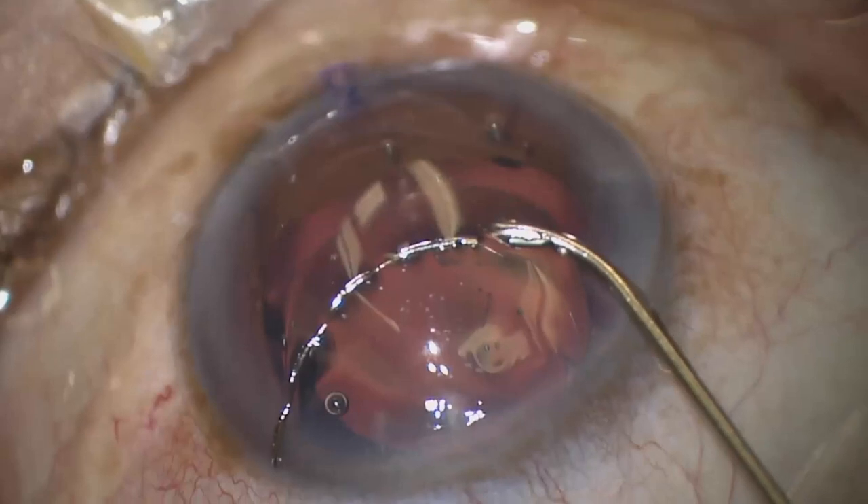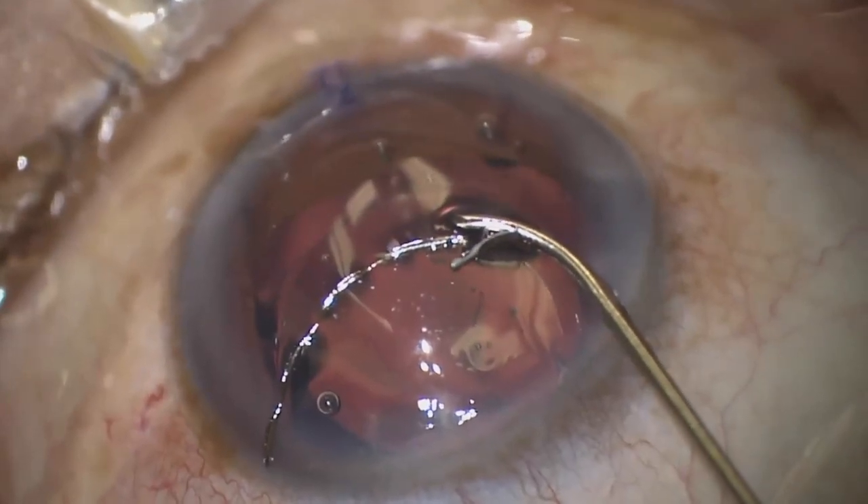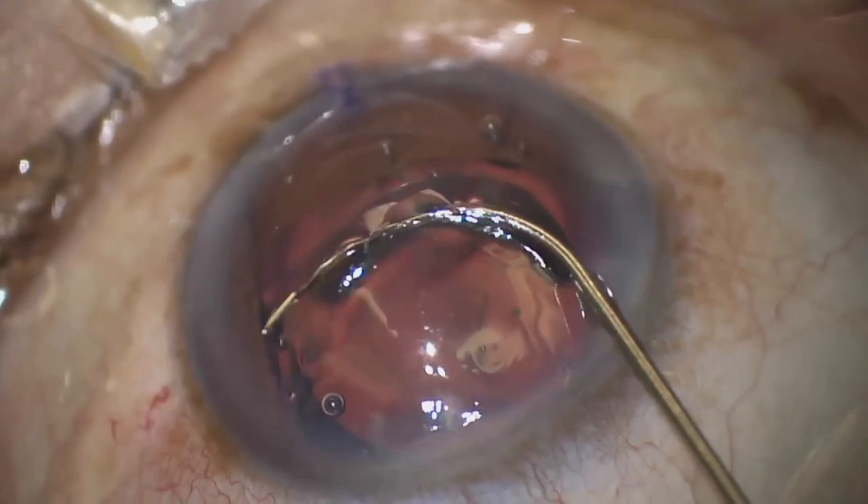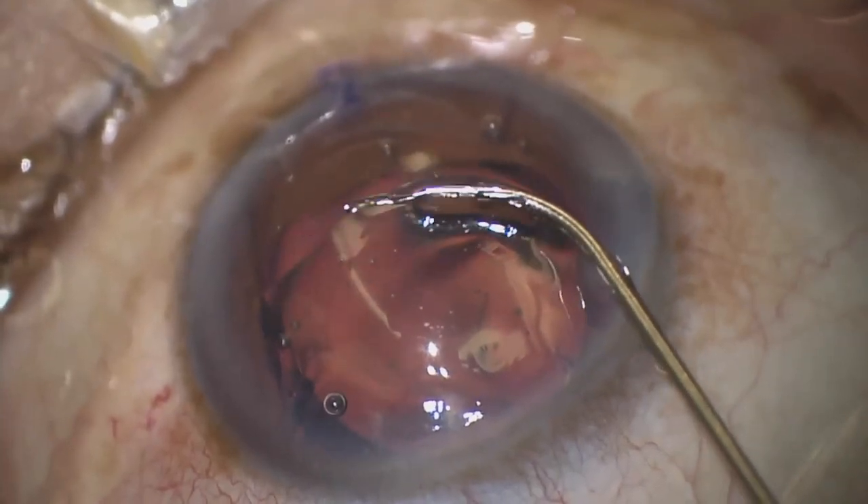To perform this, the inserter wheel is rotated to expose the interlock at the tip. Then the inlet of the stent is engaged with the interlock as the wheel is rotated in reverse, and the stent is now reloaded.